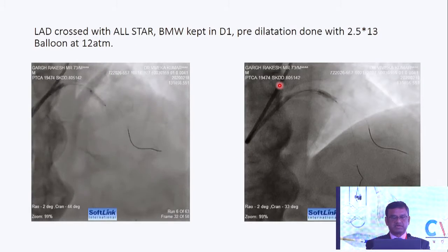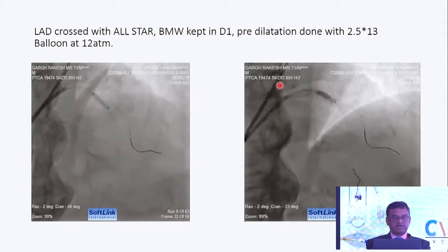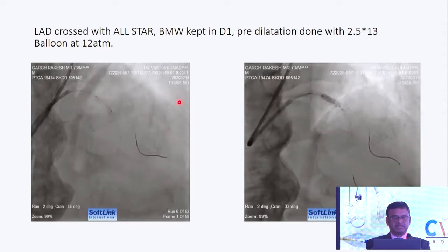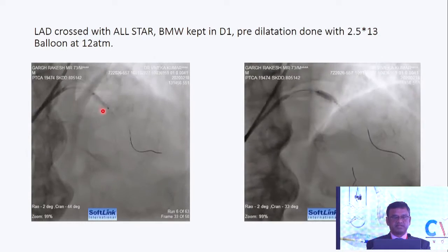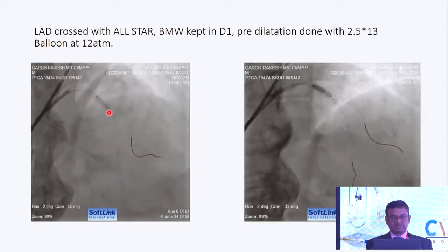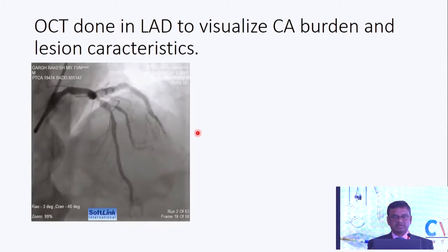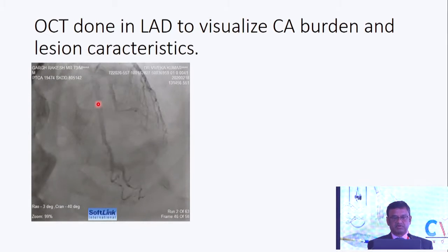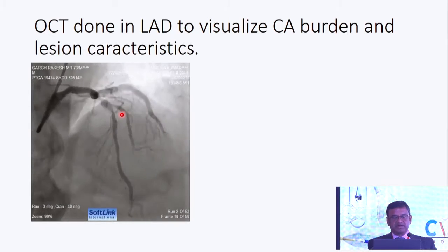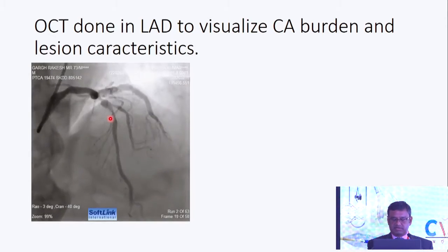This patient had come from another city where the right coronary artery was treated, but despite rotational atherectomy, the lesion in the LAD did not open well, so they did not put a stent and sent him to us. We tried to balloon it further, and you can see that it did not open at all. Despite the rota, with 1.5 burr, this was an undilatable lesion.